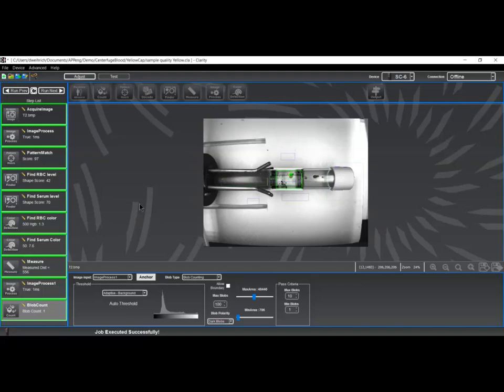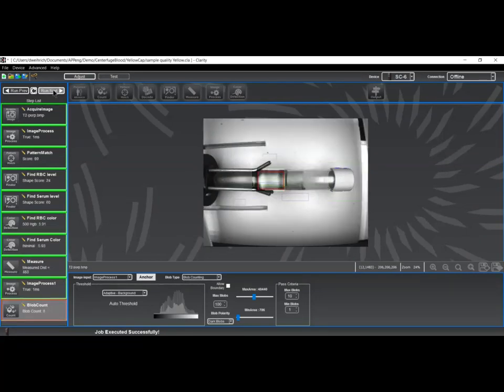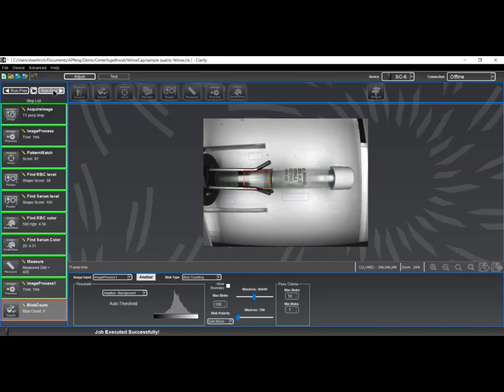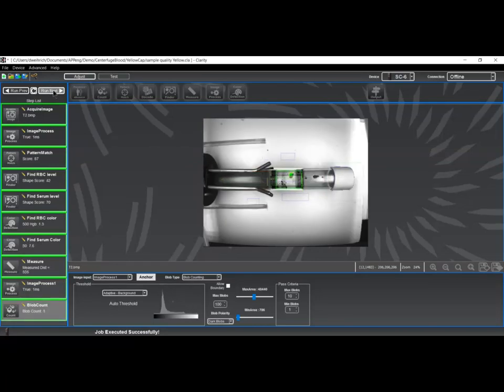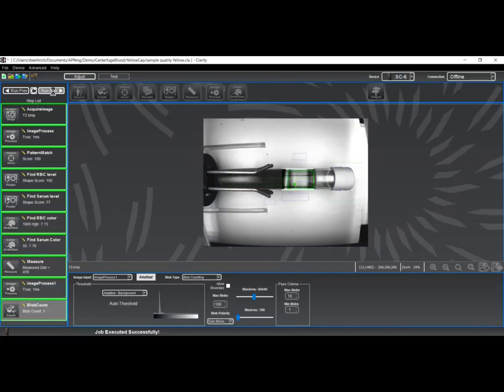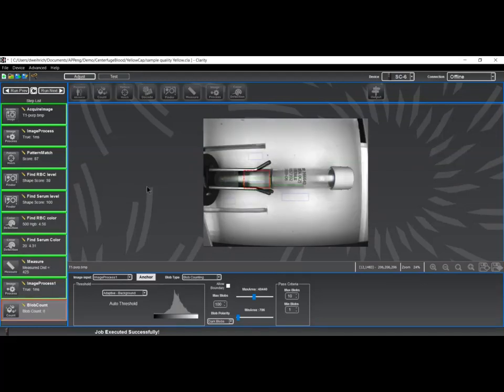In this case, what is considered to be a passing of a count of at least one blob is actually a fail in this situation. And you can see where I don't have any discernible clots or objects that are considered to be blobs, I'm showing the step as failing, and really this is actually what you want to have. Now, when I construct my output for this step, I can give it a name of a pass-fail, give it a name of clots or no clots.